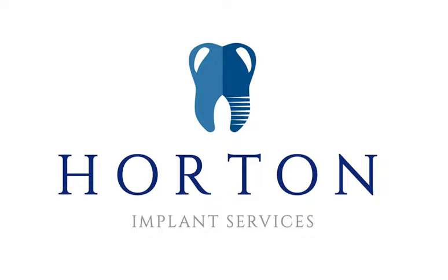So once we've determined that we have enough bone volume, then we can place our implant. And then there's what we call the bone quality. Some patients may have extremely hard bone, really solid and dense bone. This may have very little blood supply, and therefore the implant preparation may be a little bit more difficult, and we need to consider that when we are preparing for the implant, so that we don't overheat that bone too much, and that there is enough blood supply to get some healing. So we do need some blood getting there.